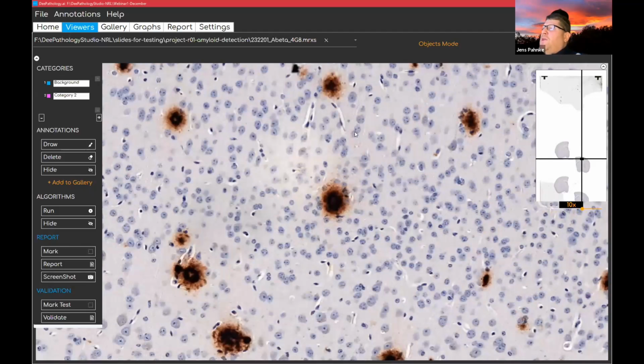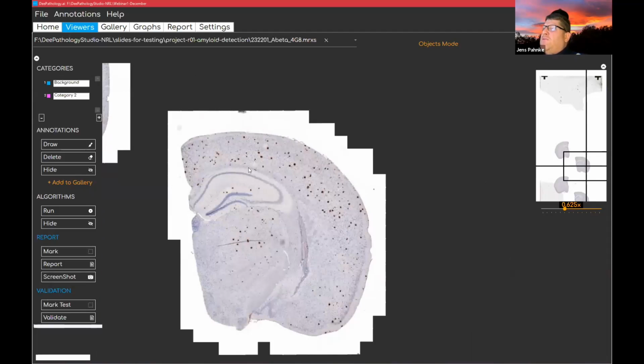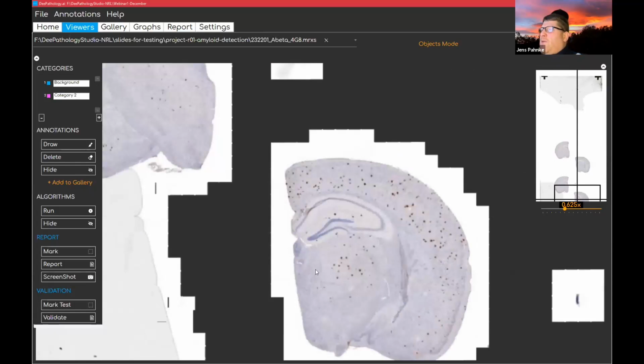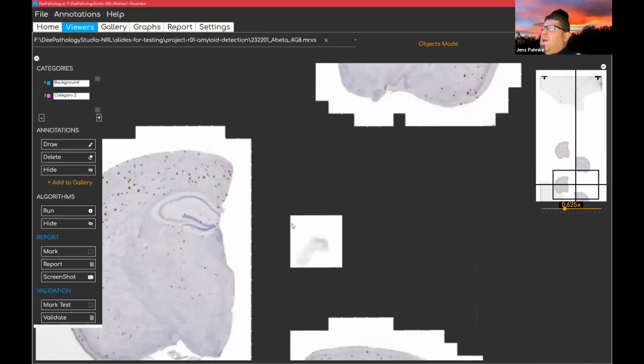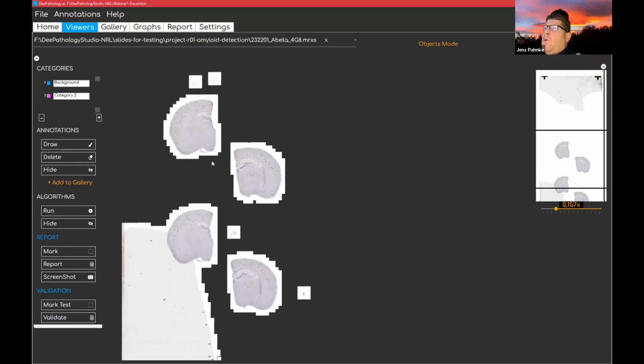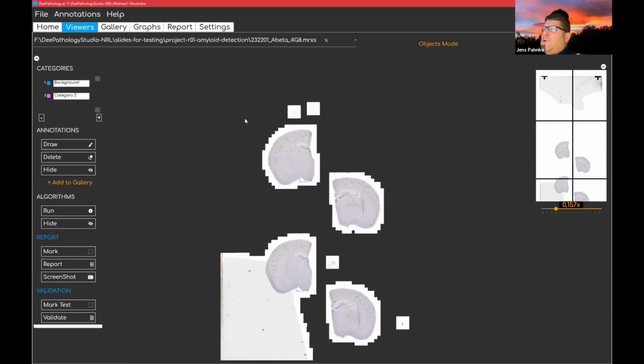In between, you see all these nice neurons here in the cortex. So we have here the cortex region. We have here the hippocampus. We have here the central basal ganglia. Here we have the CSF room with some plexus here. And if you go further down, you may have other locations. So all the mice, we have 2 sides of the mouse hemisphere always on the slide, and then we put 2 cuts on it. So we have 4 micrometers in between those.